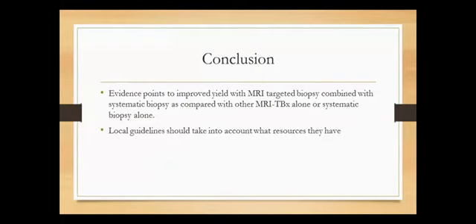Of course, we don't all have MRIs where we are, so we have to work with what we have to achieve the best results. If you don't have an MRI, it might be best to also consider other factors or other sampling methods, such as the saturation method, in that regard.